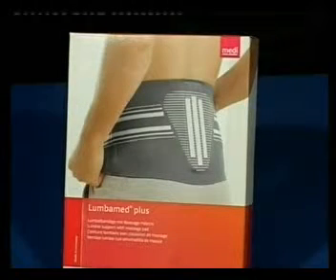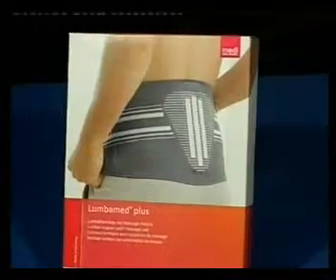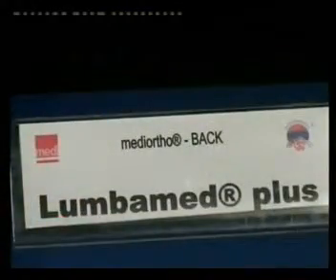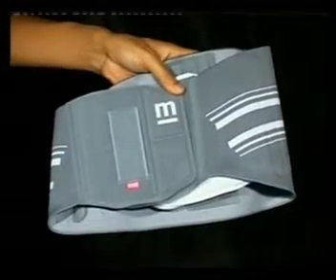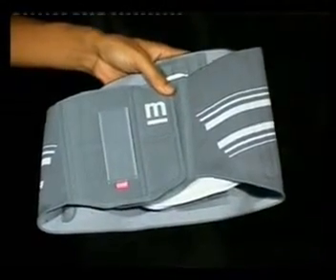Lumbamed Plus is the lumbar support with a massage pad, and the indication used for is the same as Lumbamed Basic. Lumbamed Plus is also made of climate comfort material, so it is very skin friendly and good compression is also provided.